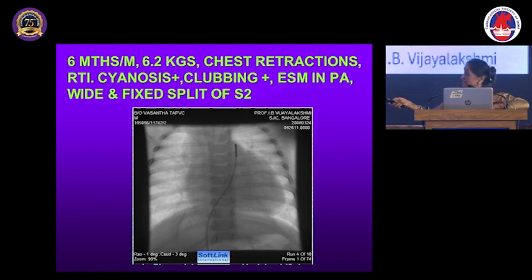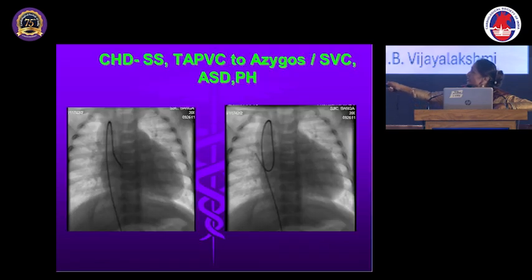So here you can see that this is there in my textbook. From the LV, simultaneous opacification is there. The pulmonary artery and aorta are side by side. They are running parallel. Here there is the aorta, the LV is committed to the aorta. So most of the dye is going into the aorta and also the pulmonary artery.